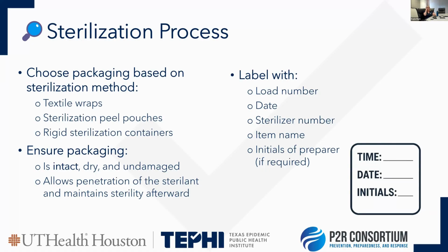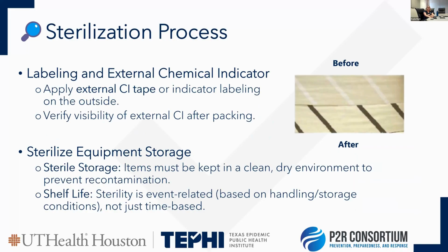This is also really helpful if there's ever an outbreak investigation, either due to equipment failure or if you're having issues with certain surgical site infections, to go back and look at this. Joint Commission and CMS will also be looking at this too, so it's a good thing just to have this process really down pretty quickly, that you can produce these logs with this information. And then lastly, then looking after it comes out, you should be able to visually see that it has been sterilized.